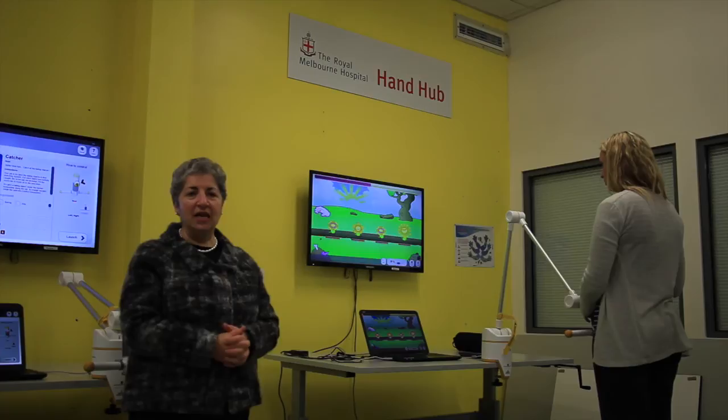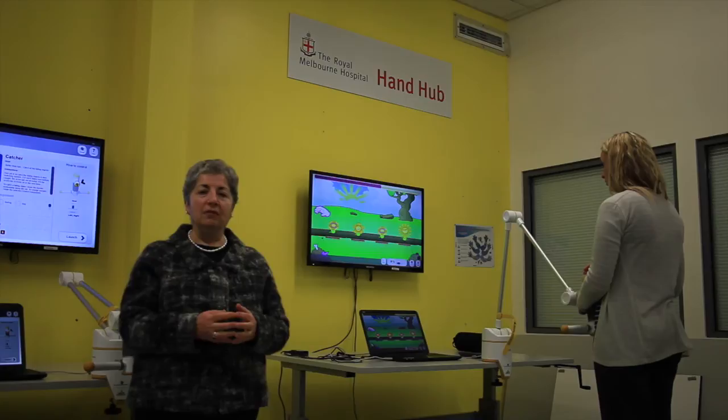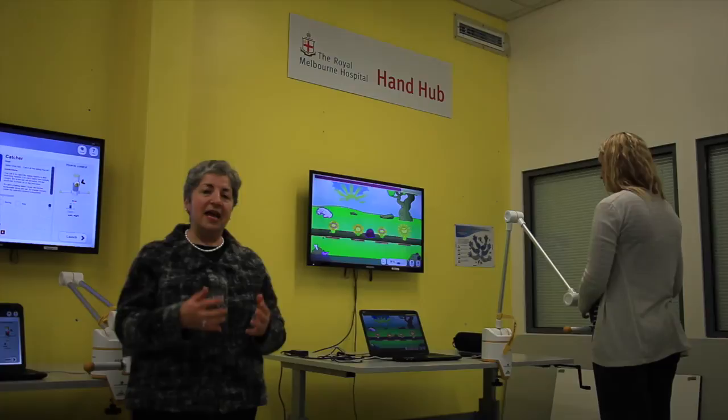The idea behind this equipment is to use technology to enable people to get more practice for their upper limb function, because during regular therapy sessions there's often a focus on lots of other things like learning to walk, balance, improving activities of daily living, and home visits. Therefore patients often don't get the opportunity to practice hand and arm activities to the extent they need to in order to improve their function.